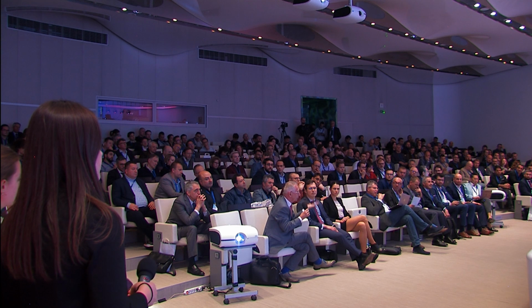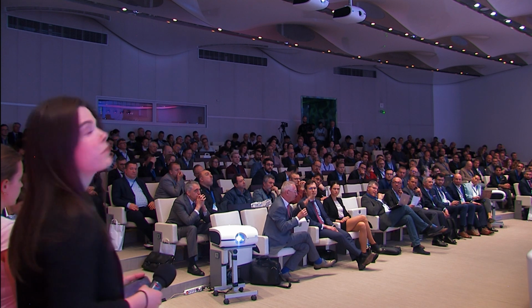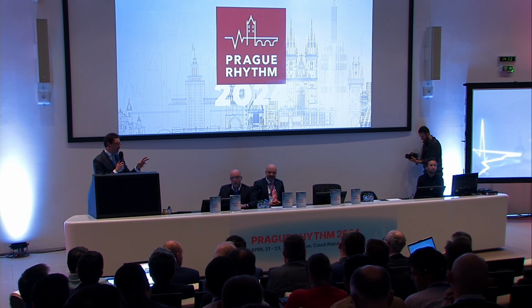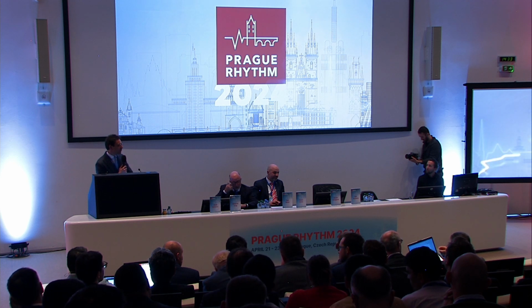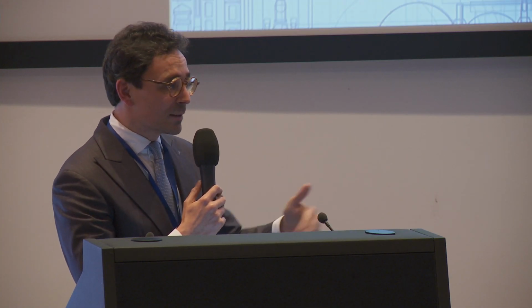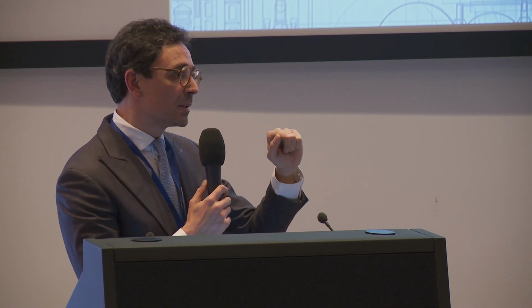The criticism about pulse field is practically no issue. I agree with you, and contact is key. And we need to study. For sure, it's a new technology, so we still need to study. We are here for study, right? Based on what you said, with the Volt we analyzed, and there is absolutely no hemolysis because you have contact, because it's sticking there. And for the pauses, we resolve it differently than atropine.